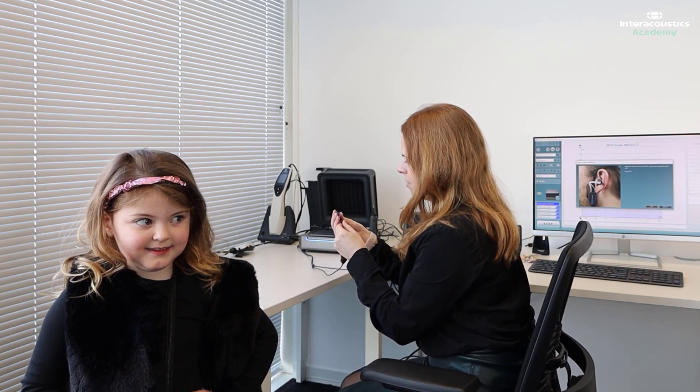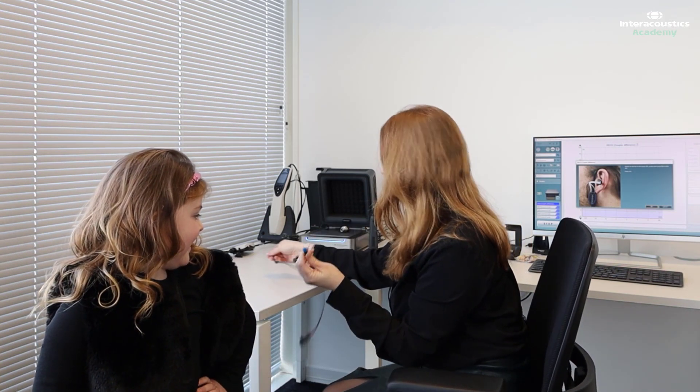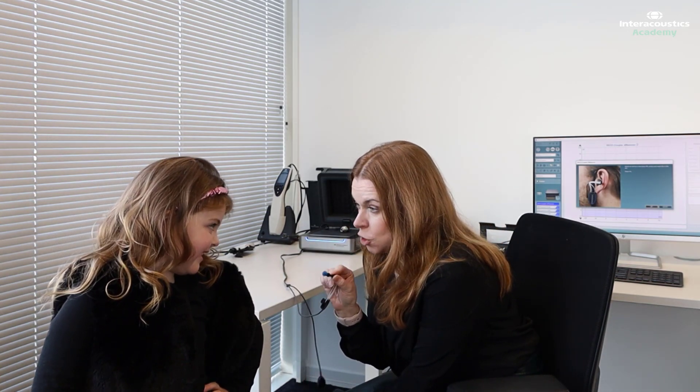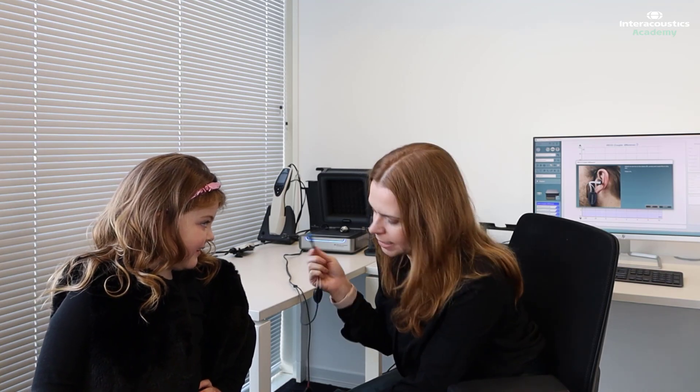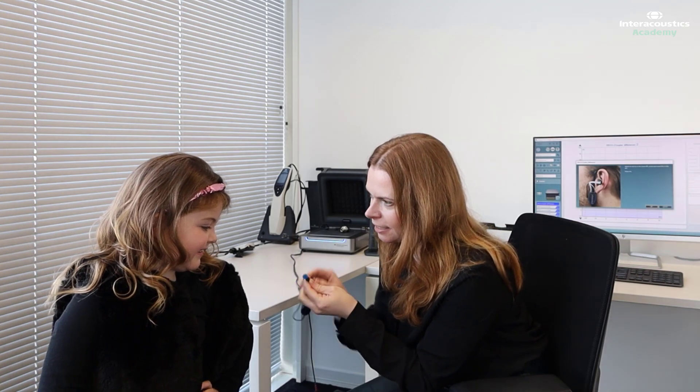I'm going to try a blue one. So Ivy, you see this little blue mushroom here? I'm just going to pop it in your ear and you're going to hear a funny sound. But your job is to stay super quiet and still like sleeping lions. Have you played sleeping lions before? Yeah. So you're going to be a sleeping lion but you're going to be standing up. Is that okay? Yeah. All right, so this is just going to go in your ear.